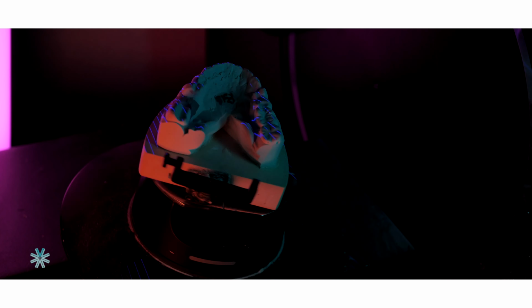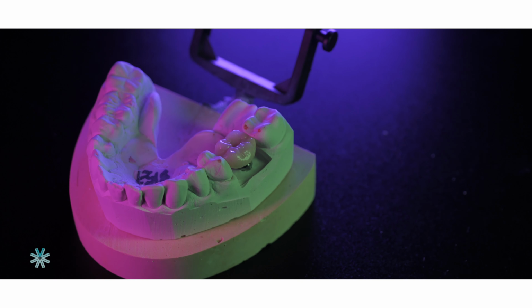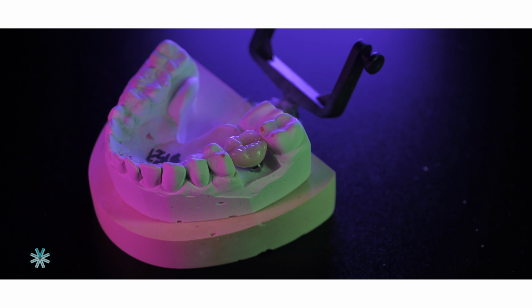Depending on the implant size you use or how big of a space you're trying to fill, the mix of those two variables can result in different design philosophies. Basically, the goal is to create an implant crown that's anatomically correct, that has a nice natural emergence profile. We also want to design the restoration so that it's durable.